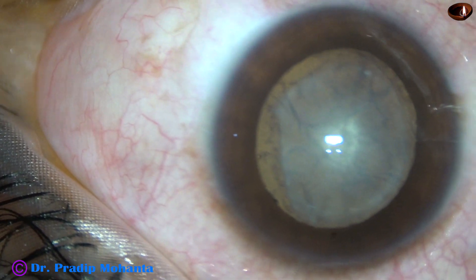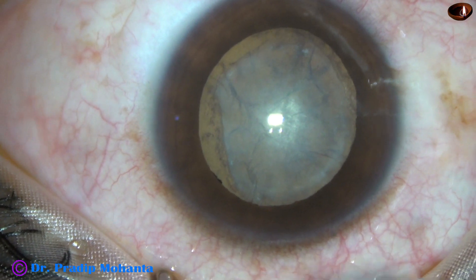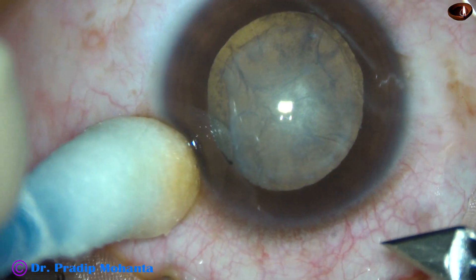This is a soft mature cataract with anterior subcapsular fibrous tissue.